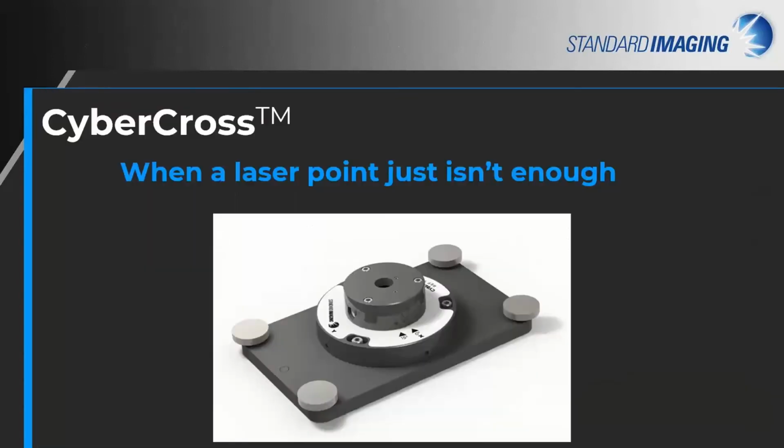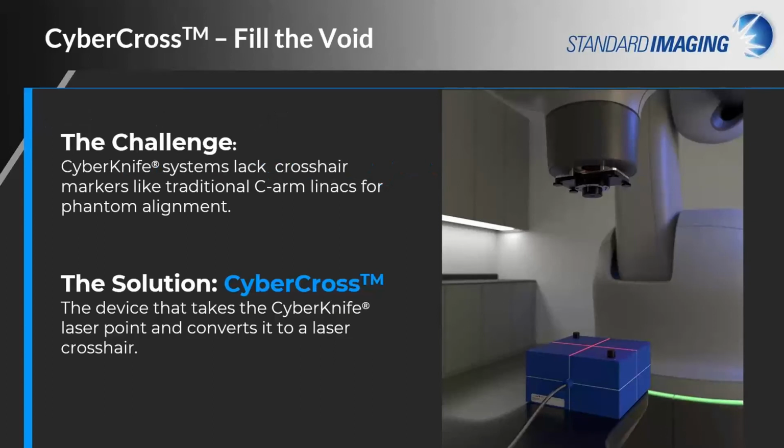So what else do we offer to make CyberKnife QA faster and easier? One tool is our CyberCross device that simplifies Phantom and QA device setup. As with many of our products, it is thanks to physicists sharing their clinical and QA challenges that led us to develop a solution for one particular challenge. And what is that challenge?